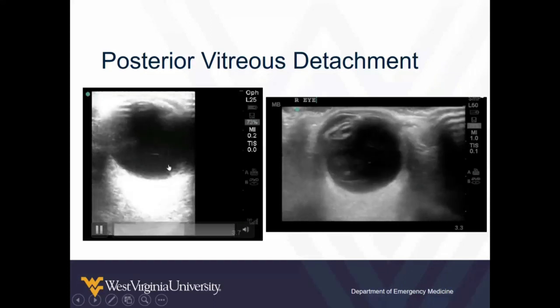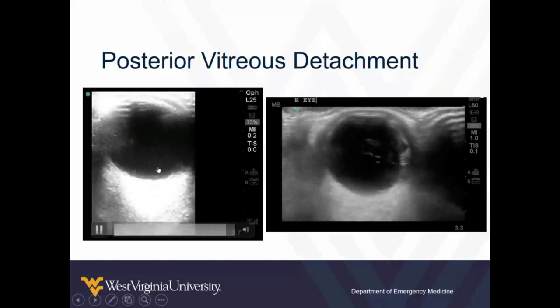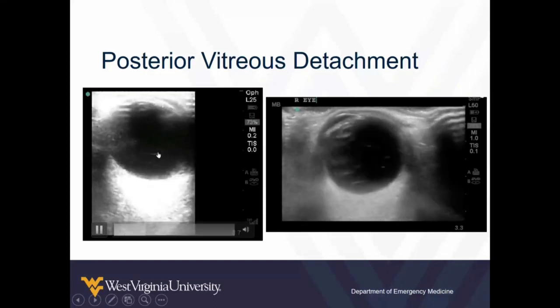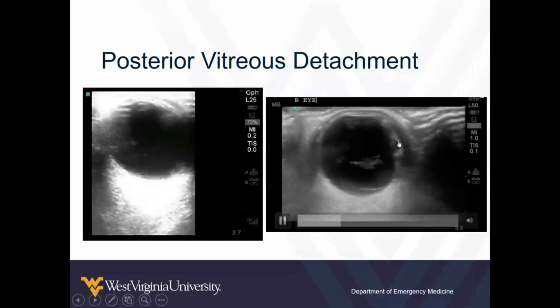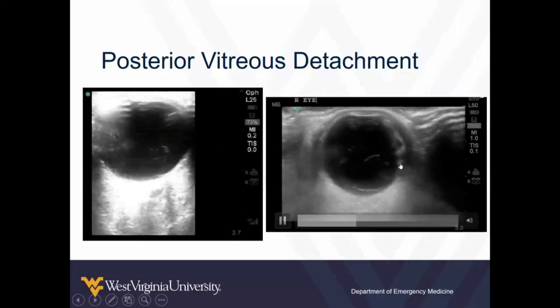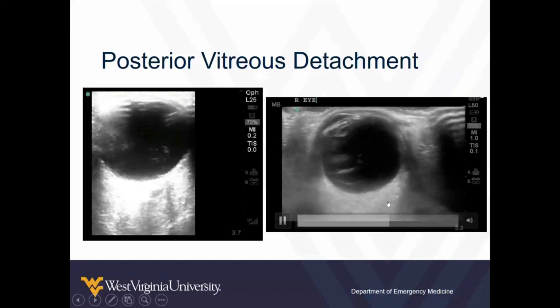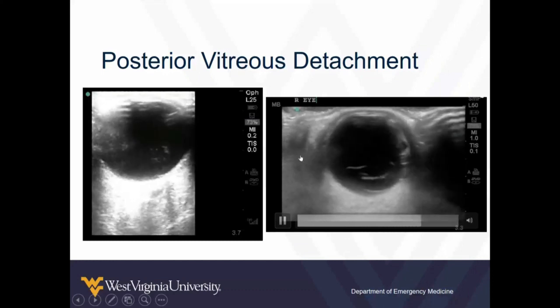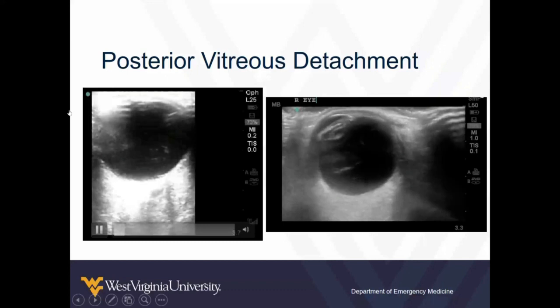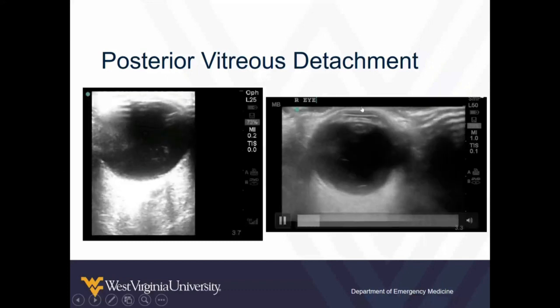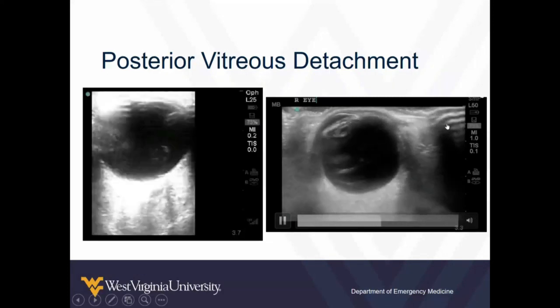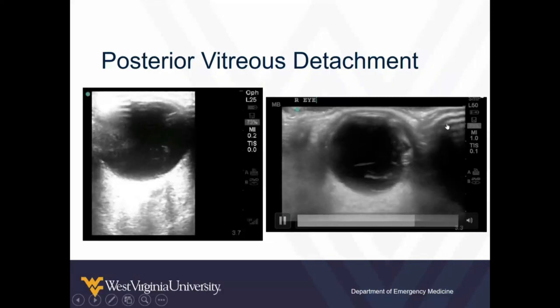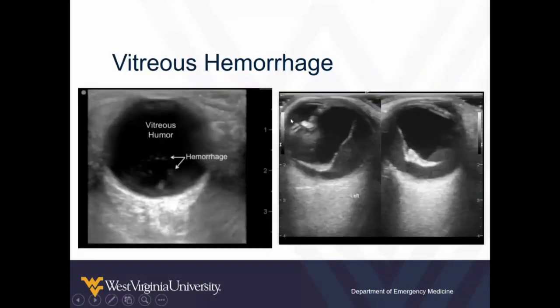Posterior vitreous detachment is not nearly as bright, thick, or heavy as retinal detachment. It doesn't look like a single sheet — you kind of see little branches and little fuzzy things going off in different directions. And it doesn't tether itself to the nerve. If you're paying close attention, you see how bright everything is around it. A lot of times to see these well, you have to really crank up the gain, which you shouldn't have to do with retinal detachment because the retina is very bright.